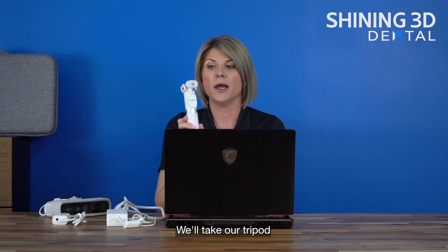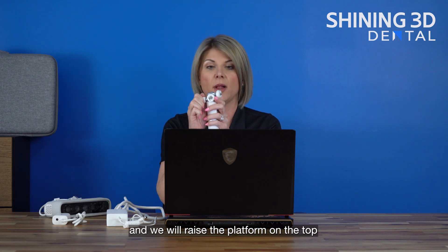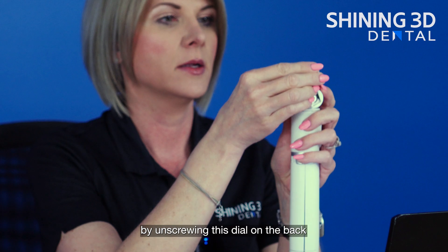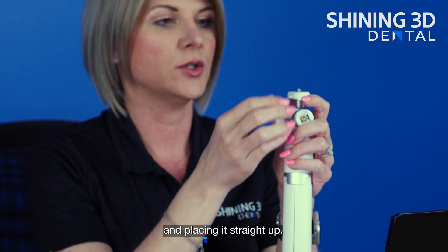We'll take our tripod and we will raise the platform on the top by unscrewing this dial on the back and placing it straight up.